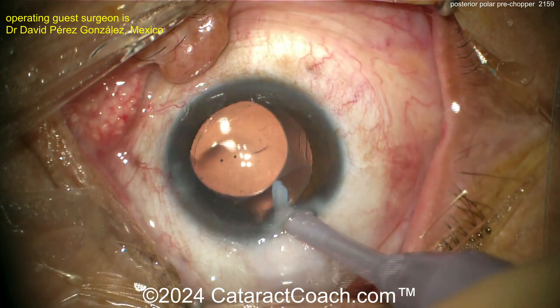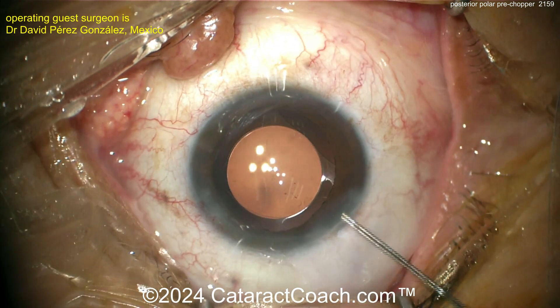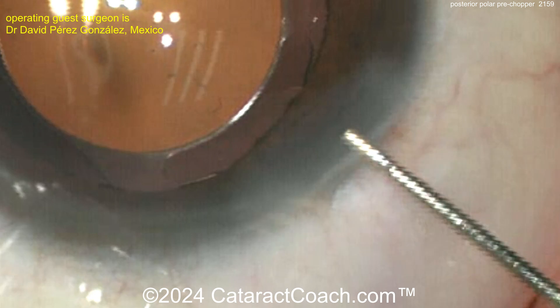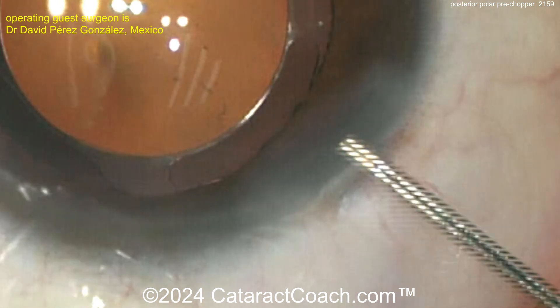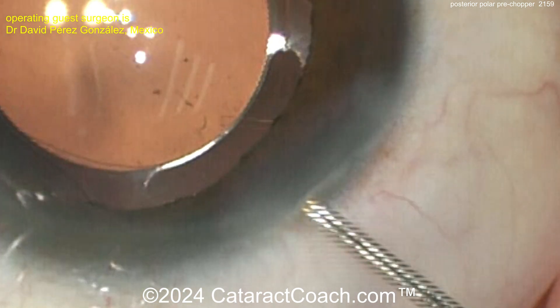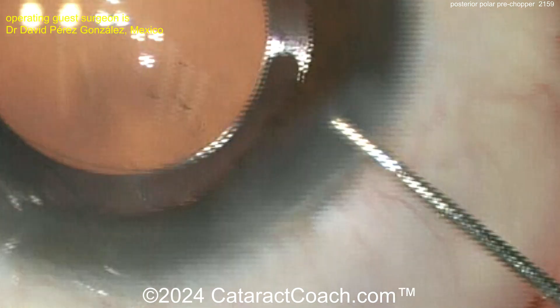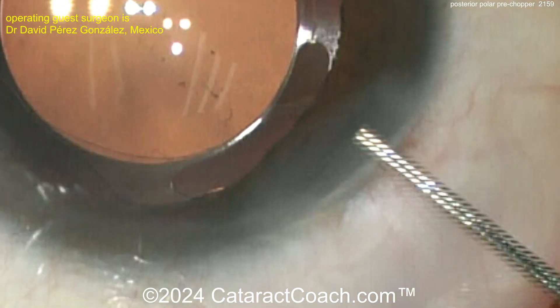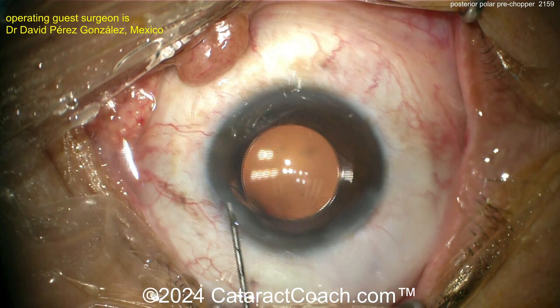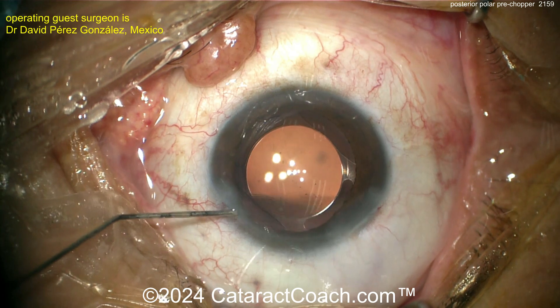A nice case — posterior polar cataract. We feature many of these on cataractcoach.com; you can see dozens of posterior polar cases there. If you have one coming up, watch those videos. Oh, notice right there — seal the incision. There's a small Descemet's detachment, honestly of no consequence. Seal the incision and it should go back into position. You don't really need a big air bubble in the eye.